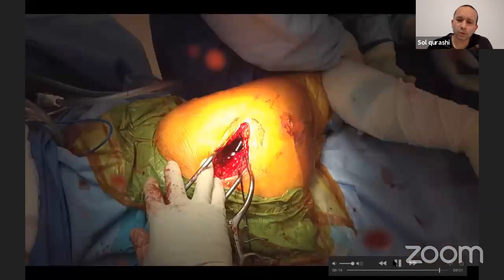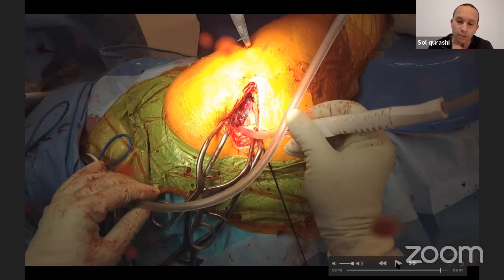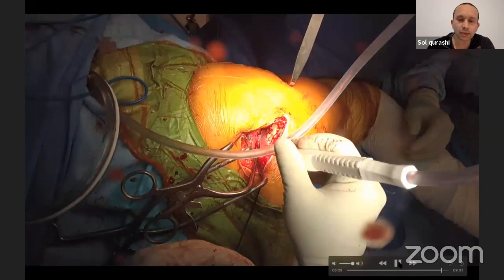Now the design surgeons, they probably got a bit of criticism from Ceramtech, or someone gave them a hard time. So they've also described the ex-situ reduction, where you just relocate it like a posterior approach. You put the head on, tap it, and then relocate it. But for that, obviously you have to release a bit more of the external rotators, which obviously has implications. And then you repair the capsule, then you let go of the self-retainers, and hopefully you'll be able to see the intact rotators.